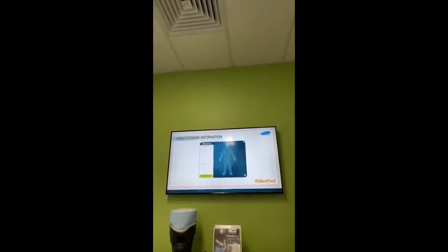So you enter all the information: your practitioner's first name, last name, where you're from, your email address, street address, and obviously city, country. Everywhere where it's a required field, you need to enter and save the information to go on to the next screen.